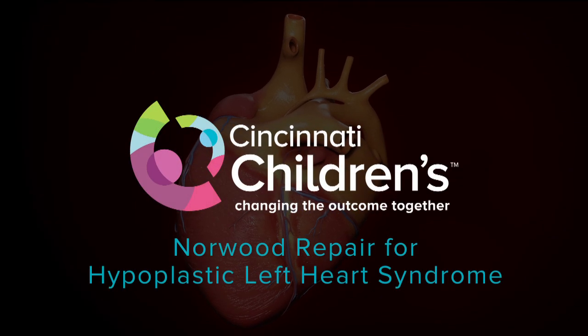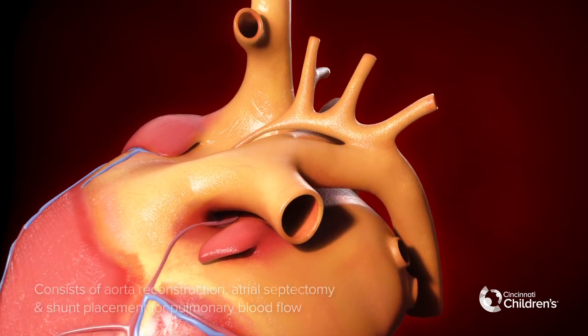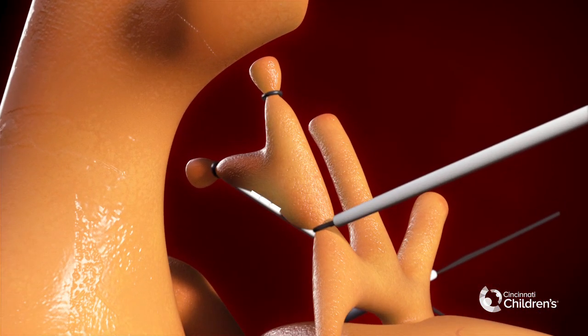The Norwood operation is the first stage surgical palliation for hypoplastic left heart syndrome, also known as HLHS. This consists of aortic arch reconstruction, atrial septectomy, and shunt placement for pulmonary blood flow.